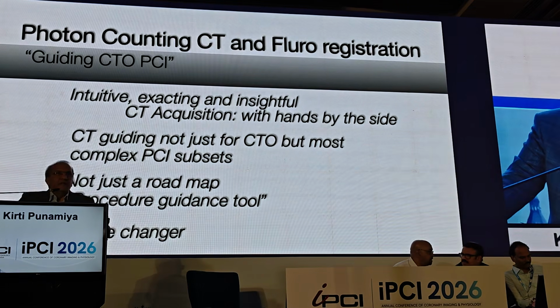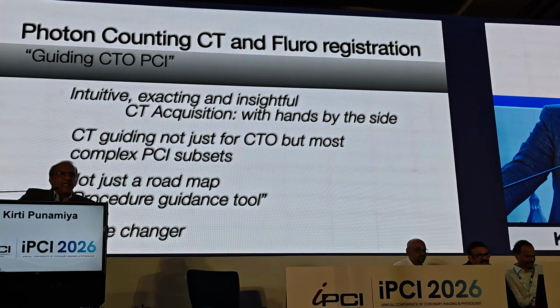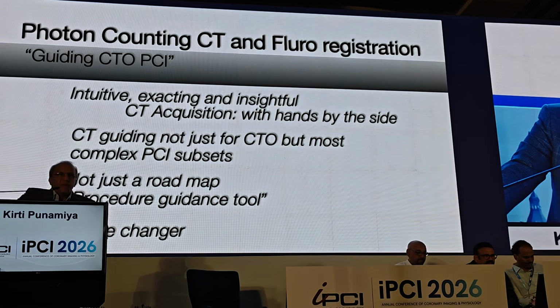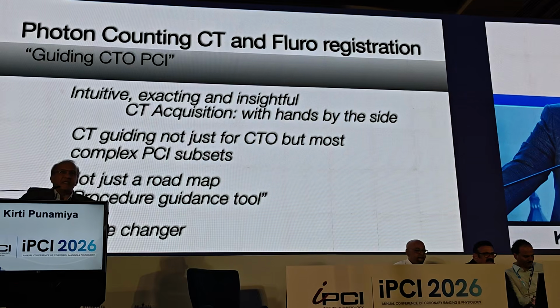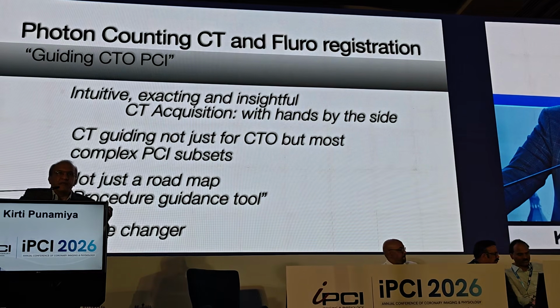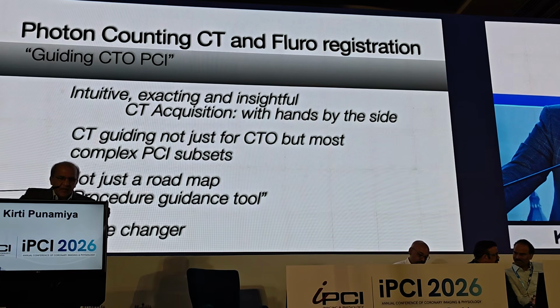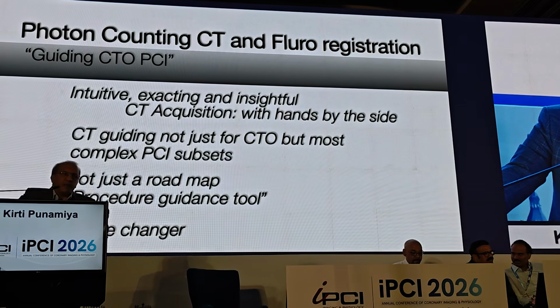In conclusion, it's intuitive, it's exacting, it's insightful. The CT acquisition with hands by the side is what we have now decided to do to make it a little better. CT is CT guiding not just for CTO, but for most complex PCI.